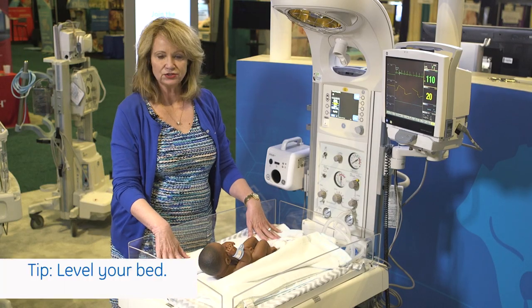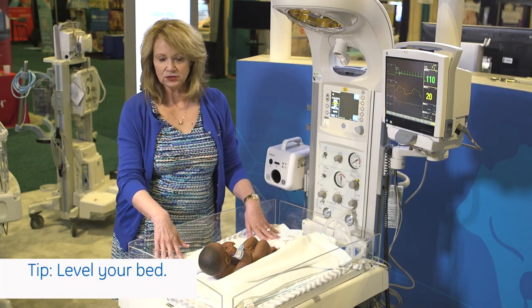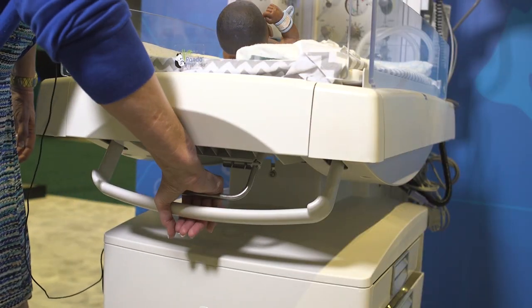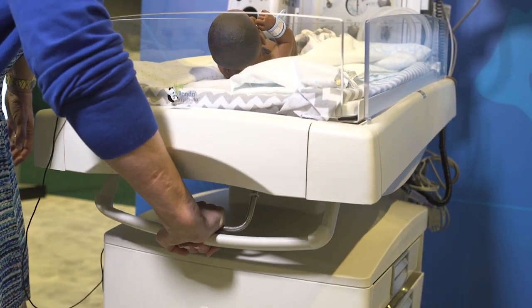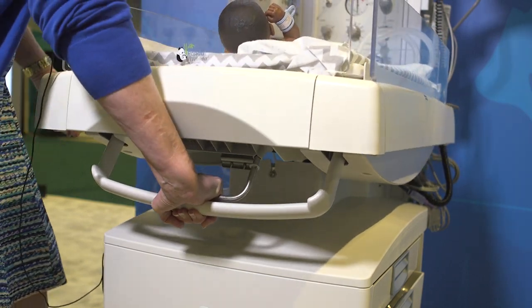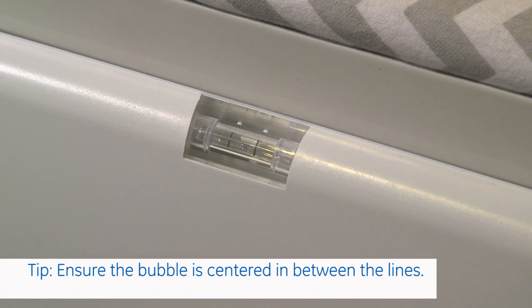You also want to make sure that the bed is level. To level your bed, you would just place your hand across the metal bar and squeeze, and then you can level the bed. This bed will actually tilt 12 degrees either way, and there is a level button on either side.